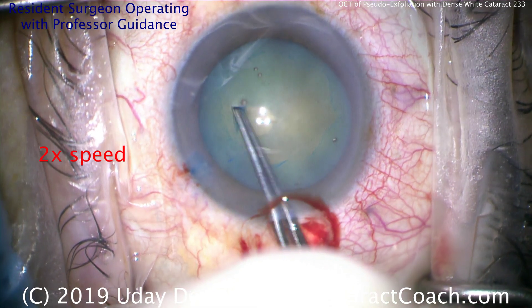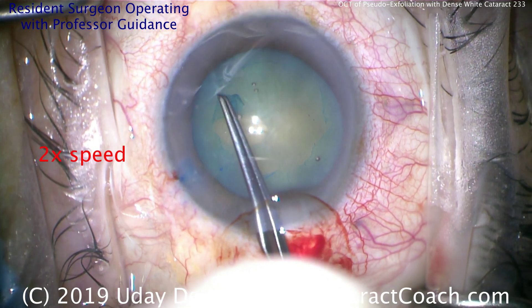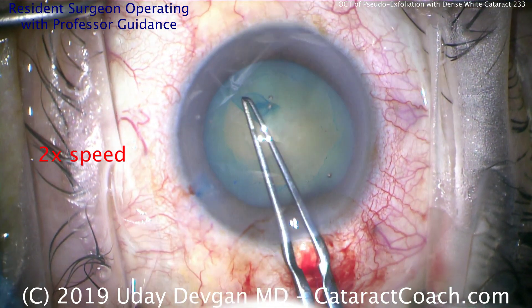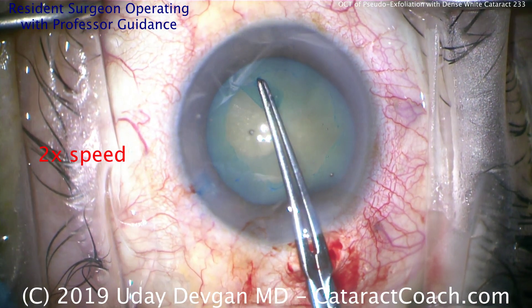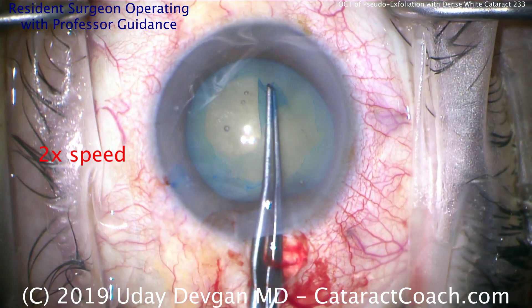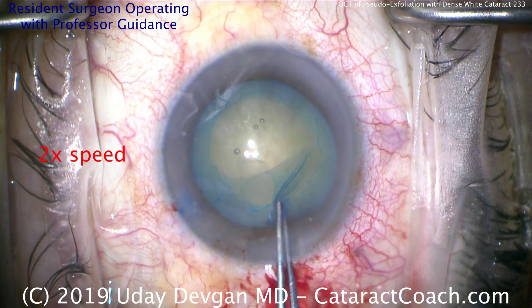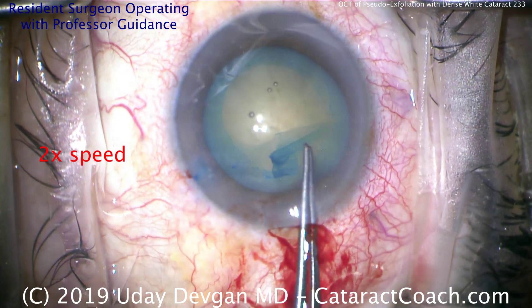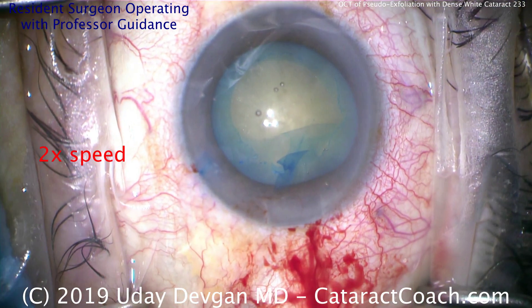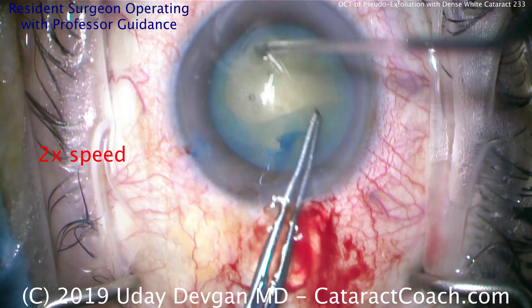Now we'll go ahead to the capsulorhexis — we have this at two times speed just to be a little more efficient. The resident is going in a clockwise manner. Important not to make a tiny capsulorhexis. In patients with pseudoexfoliation, there can be capsule contraction and phimosis of the anterior capsulotomy in the post-op period. It's important to start with a sufficiently large capsulorhexis — aim for at least five millimeters. In this hyperopic eye with a smaller anterior segment, we need to make it a little larger.